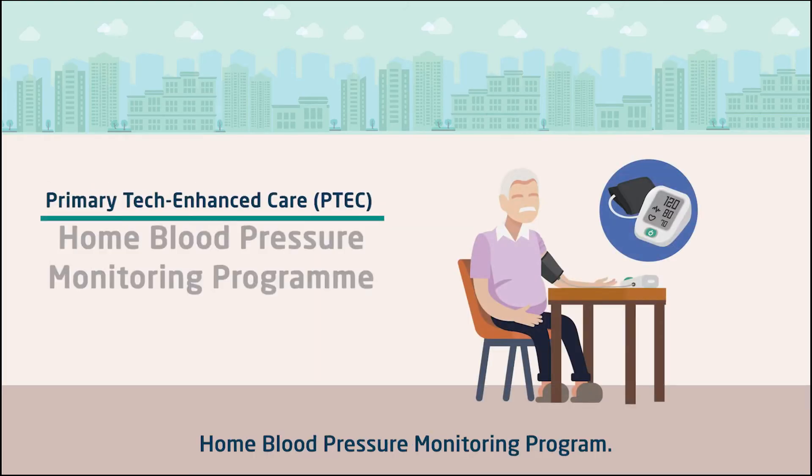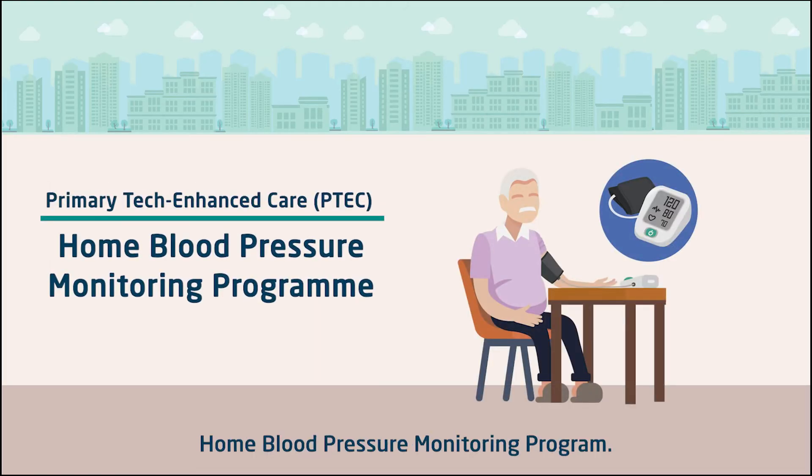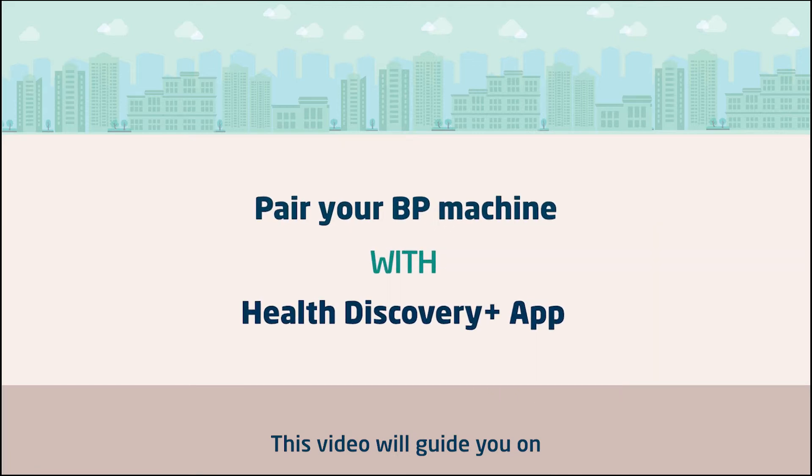Thank you for enrolling to P-TECH's Home Blood Pressure Monitoring Program. This video will guide you on how to pair your BP machine with the app.